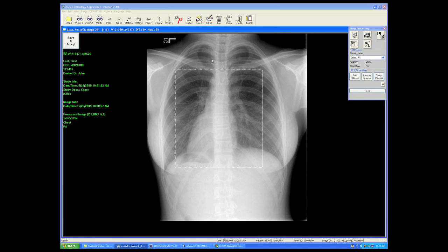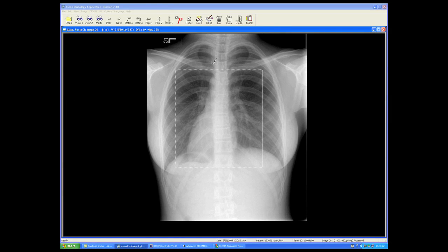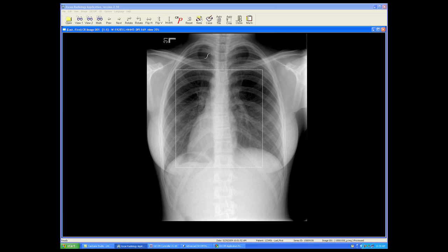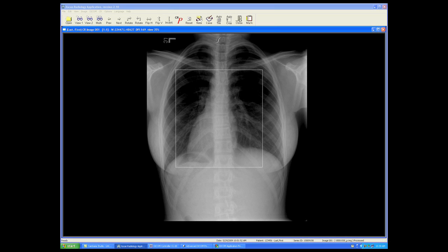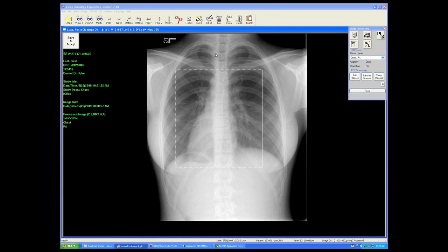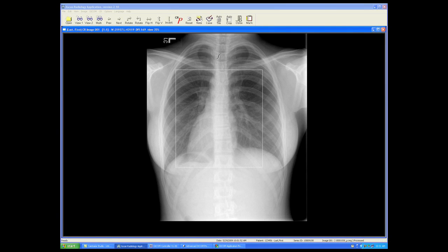There is a fine adjustment that can be applied, and that is using the center scroll wheel. If you press down on the center scroll wheel of your mouse until your cursor turns into a squiggle on the screen, by dragging that squiggle to the right, we introduce more gray. To the left, we introduce more contrast. By raising it up, we make the image darker. By moving the cursor down, we make the image brighter. So we have a fine adjustment of the window and level with the window and level tool, located on the center scroll wheel of the mouse by pressing down on it.